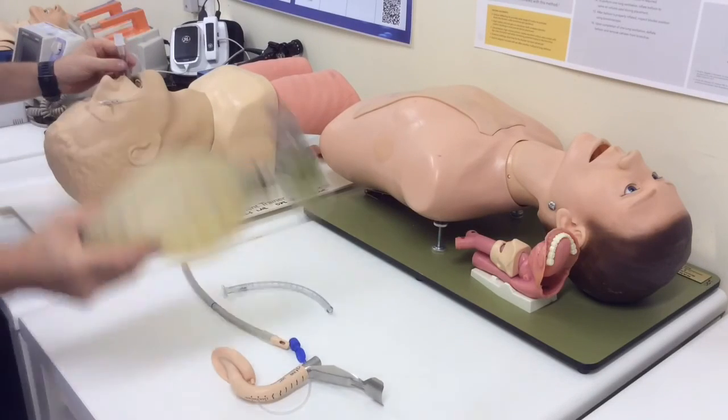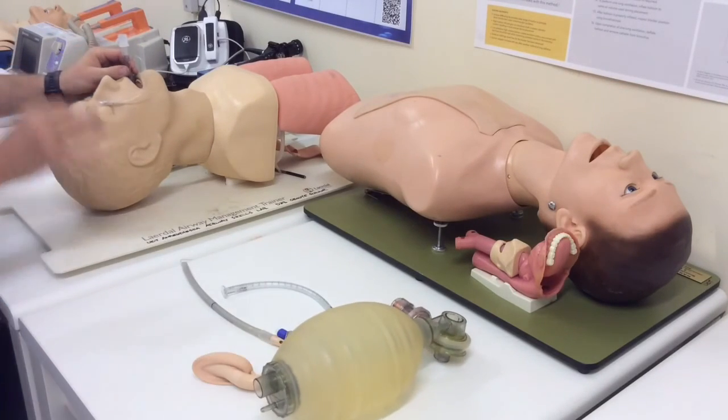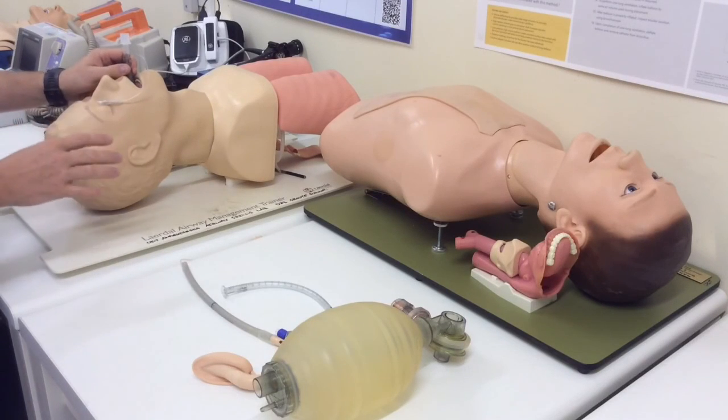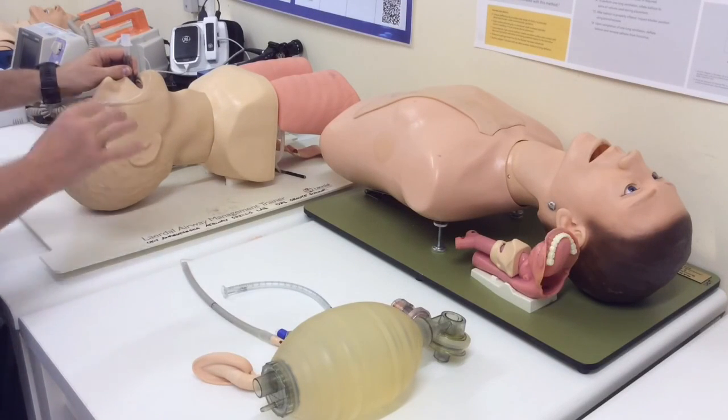So that's the Fastrach intubating LMA, a very, very useful device. And studies have shown LMA placement success with this device approaching 100%, intubation success, depending on the study, in the high 90s. So a very, very useful device.